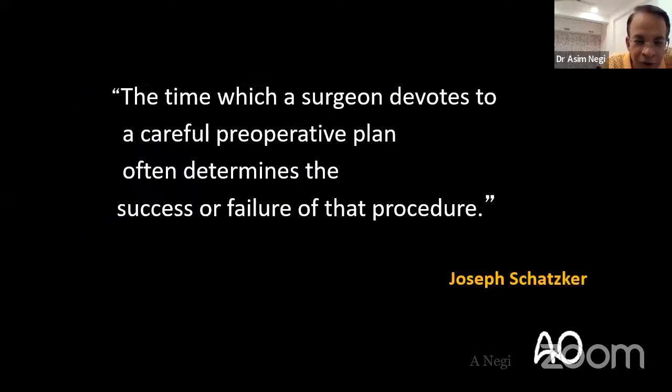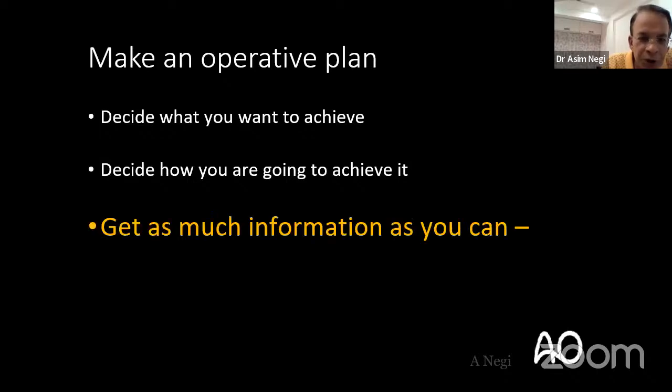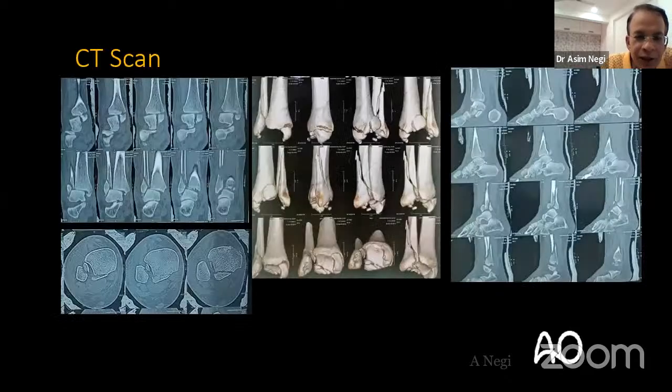You have to plan the surgery meticulously. Decide your objective, how you are going to achieve it, and get as much information as you can before you proceed with the surgery. CT is almost mandatory to treat any intra-articular fracture. And read all the images yourself, don't just read the report from the radiologist. You should be able to read the 2D images, which are extremely important. You can see there is a large posterolateral malleolar fragment beside the fibular fracture and the medial malleolus.